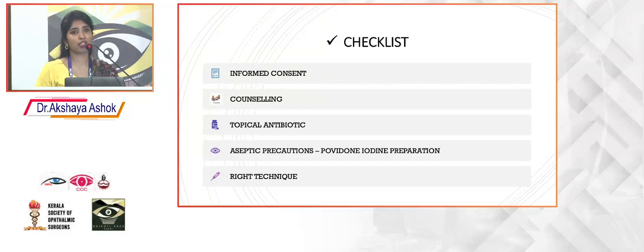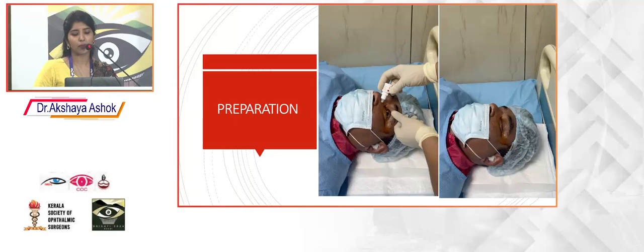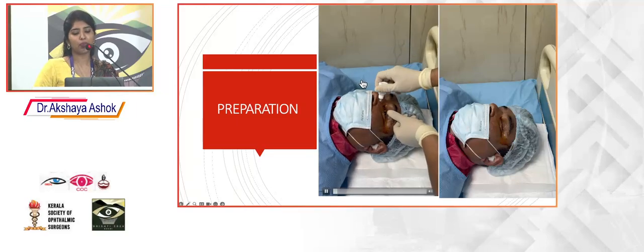Every step while giving the injection should be done under thorough aseptic precautions. Any active lid infections should be looked out for and treated before giving injections. Any hordeolums or blepharitis should be treated before giving an intravitreal injection, because these could be a strong source of infection following the injection.